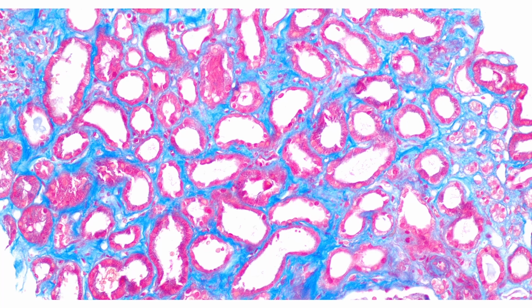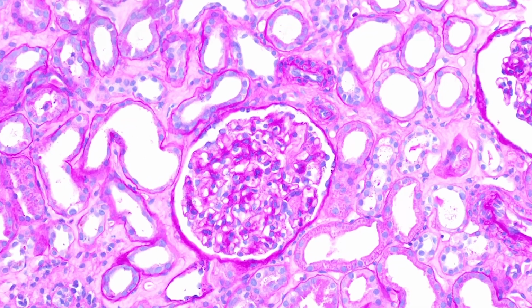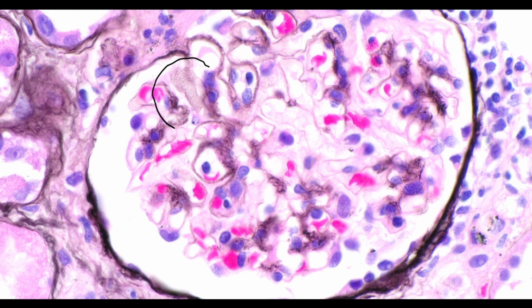What about the glomeruli? So here we can see that the glomeruli are actually pretty unremarkable. They don't show any mesangial expansion. There's no endocapillary hypercellularity, no fibrinoid necrosis or crescent formation. But when we look at the Jones stain, we can see that there are some segmental holes in some areas.